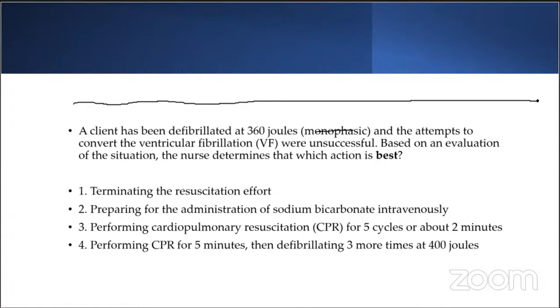So again, we were talking about cases before I digress. So let's go back. What other reading? So now there's no electrical activity. The ECG remains on the isoelectric line. So let's assume the heart is fibrillating. Now, when the heart is fibrillating, what actually happens?